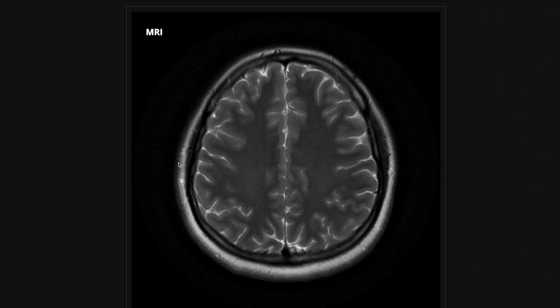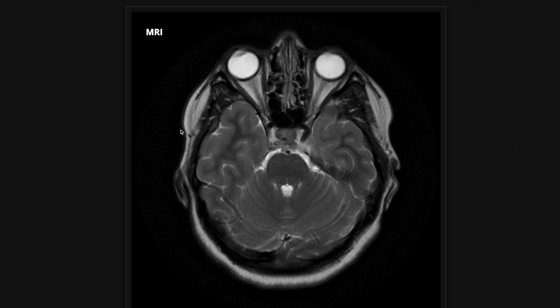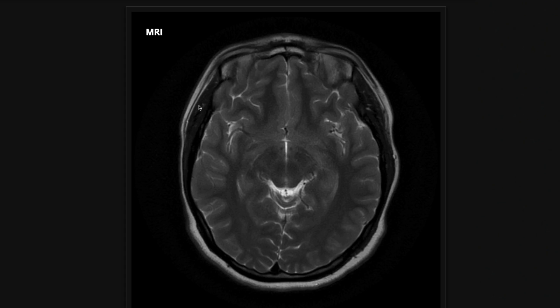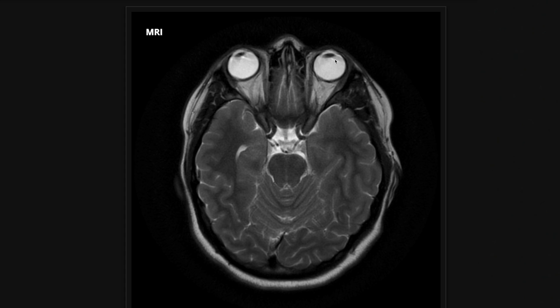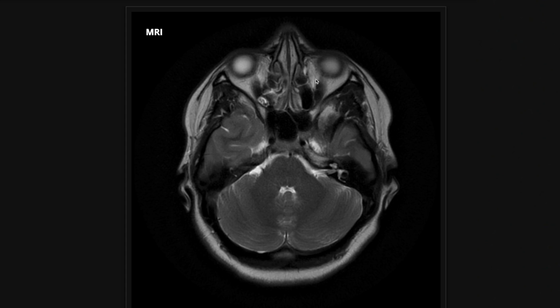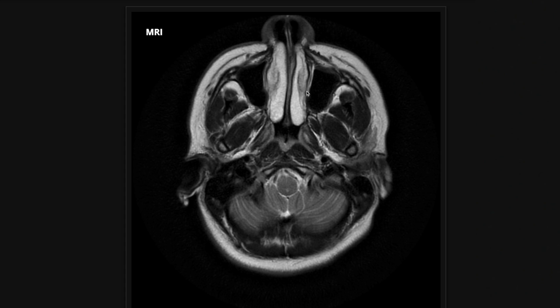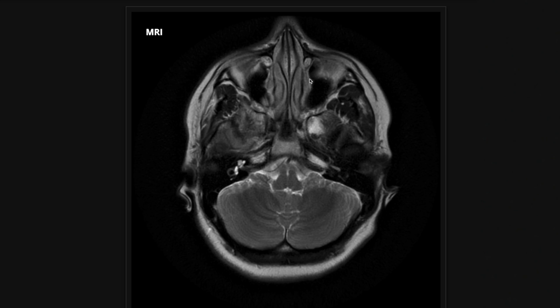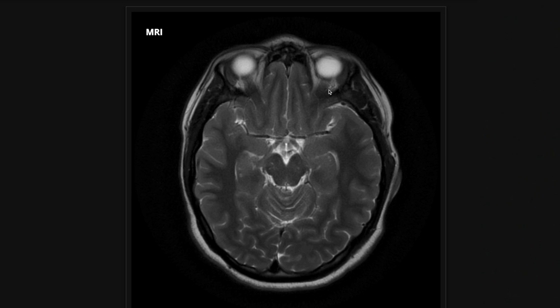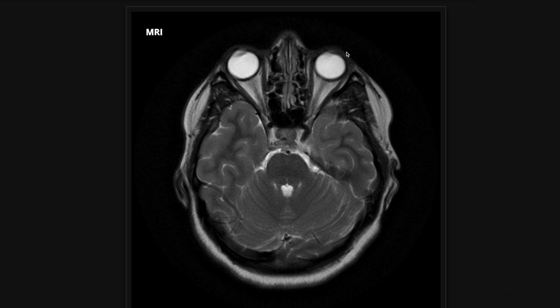Before we move on from the axial T2, a couple of other things you can look at: I think the sequence is best for the orbits and the sinuses. You can catch sinus disease, be it fluid levels in acute sinusitis. And of course you have fungal sinusitis, which is a whole other story — you're going to want intravenous contrast to evaluate for that. But your sinuses and orbits are another good thing to look at on the axial T2.